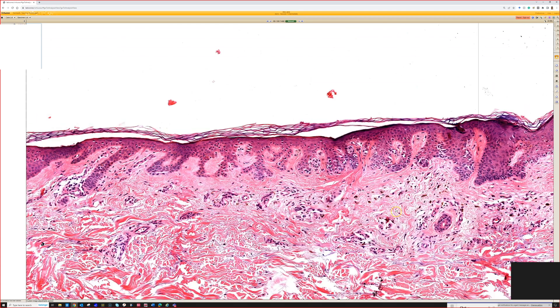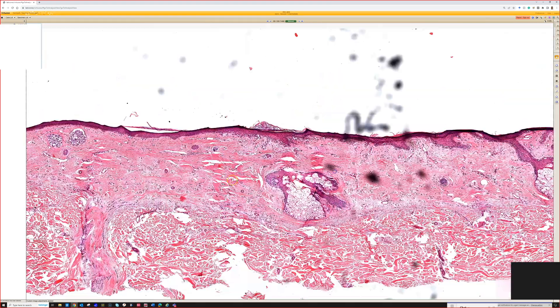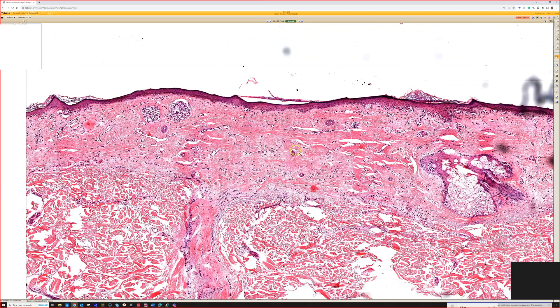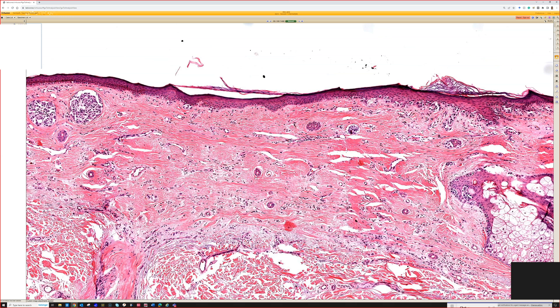That's an important reason why we need to see the whole lesion. This is a melanoma with regression — a very dense kind of regression in this case. In earlier regression the collagen is more loose and mixed with pigment incontinence and inflammation, but sometimes it gets dense and burns out, becoming very dense and sclerotic, almost morphea-like. Just know that regression can be this dense, but sometimes it's much looser and more inflamed. When it's dense like this it becomes much more difficult to tell apart from actual scar.